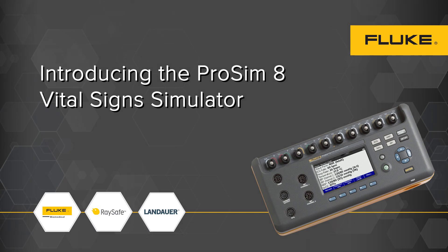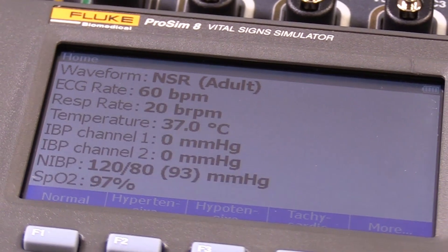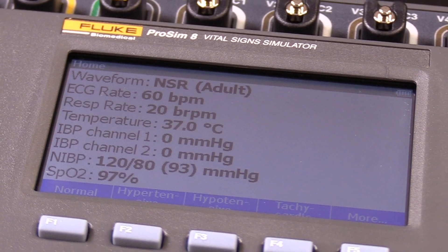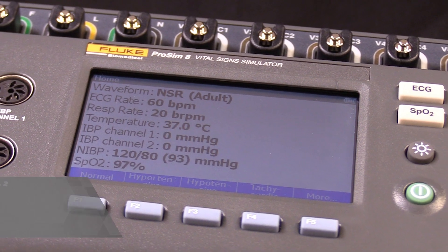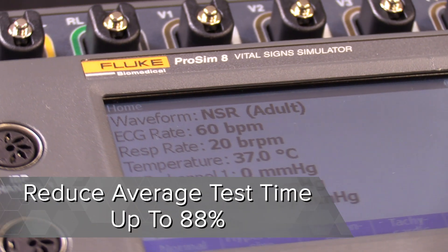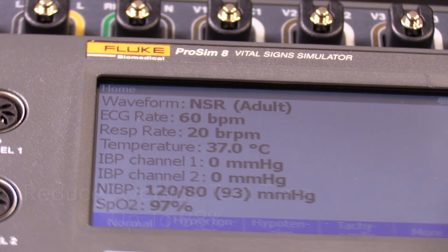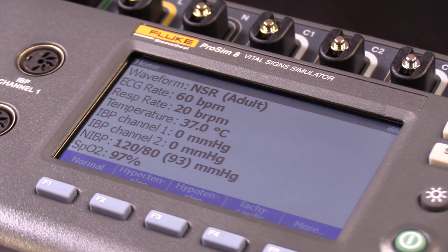Introducing the ProSim 8 Vital Sign Simulator. The industry-leading ProSim 8 Patient Simulator enables you to complete preventative maintenance testing with one device in less than five minutes, reducing average test time by up to 88%. The ProSim 8 Patient Simulator is also ideal for design engineers looking for known physiological signal output.